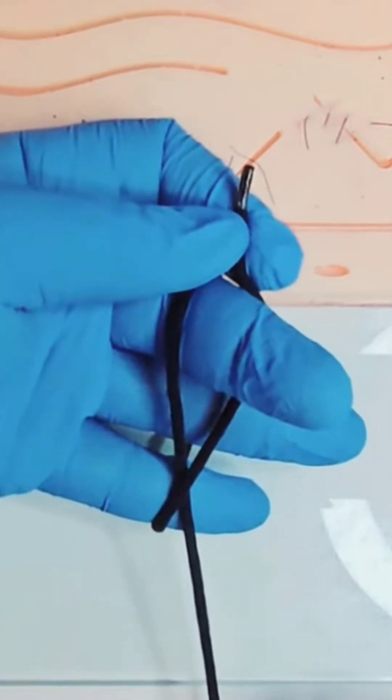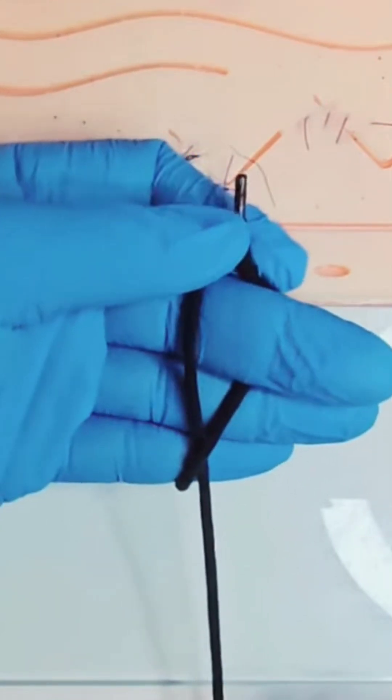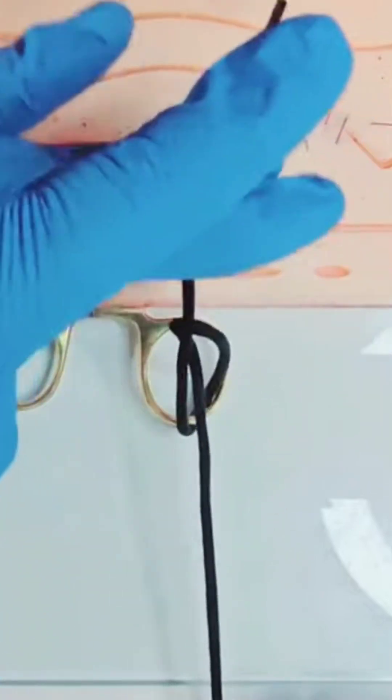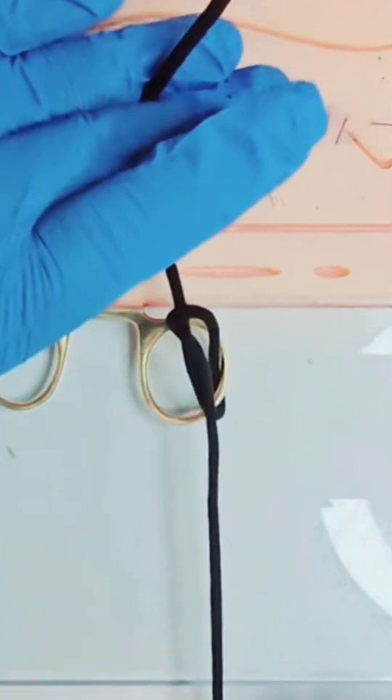Squeeze the short thread between middle and ring, release the pinch grip and pull the short thread away from you. Now tighten this knot.